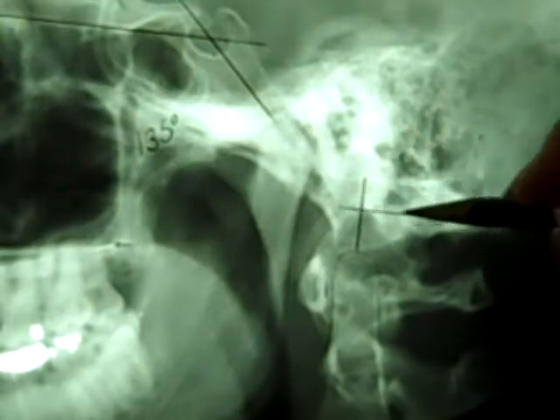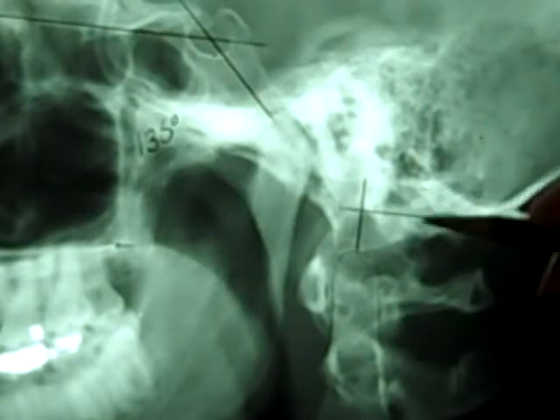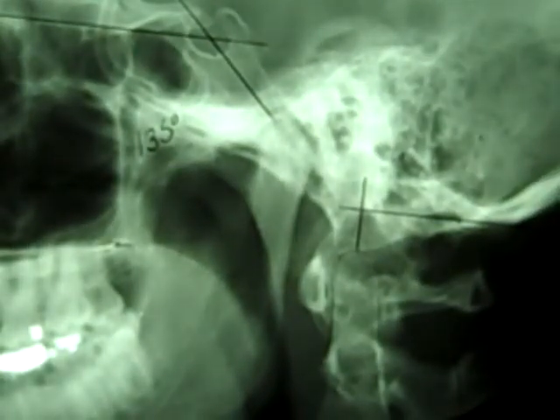This is a space that should be occupied by the neural canal. We don't want to find a dens stuck back in this area. That would be bad news. All right, so on this page we have 4 processes to find platybasia. We have basilar angle, McGregor's, Chamberlain's, and McRae's.